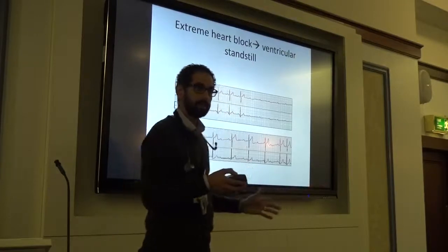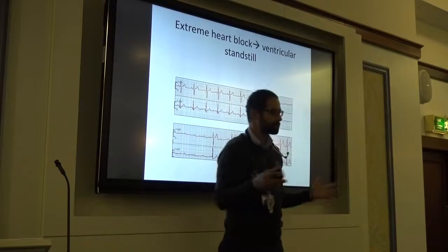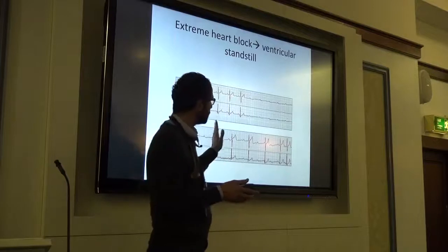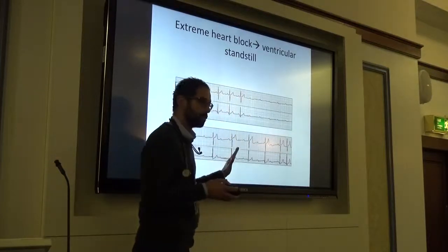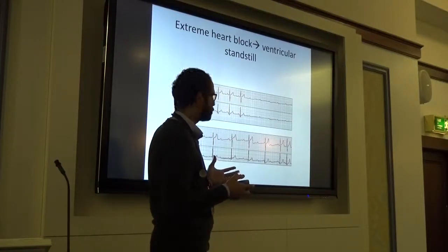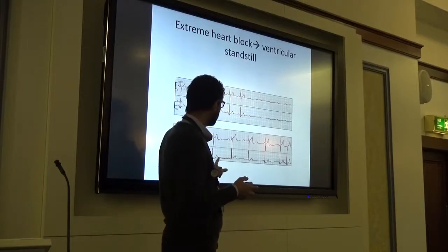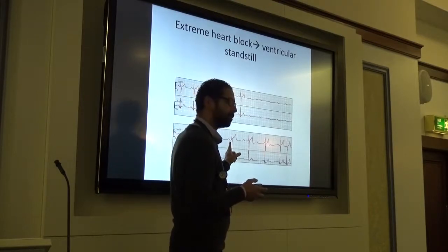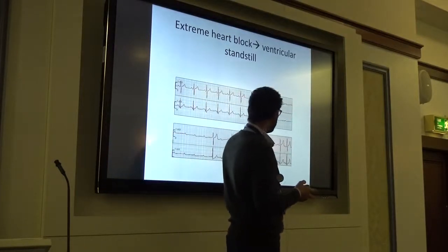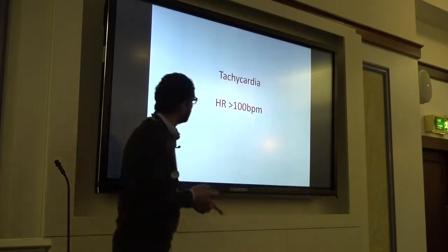Collapse, exactly. If you're seeing someone with a collapse, this is usually the ambulance ECG that gets thrown away when the patient goes to the wards. These are very important, because if you see this, it explains why the patient collapsed. And you can see this patient has serious conduction issues, because when the node starts picking up again, you start having 2 to 1, and then first degree, then complete heart block here. You see this P wave is not marching in and out of the QRSs. Good.